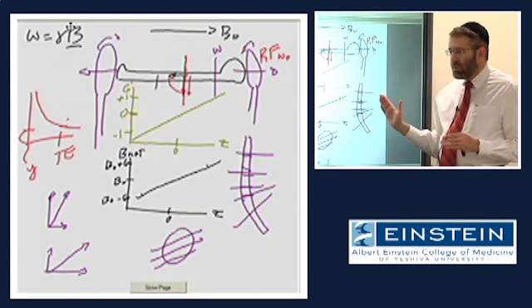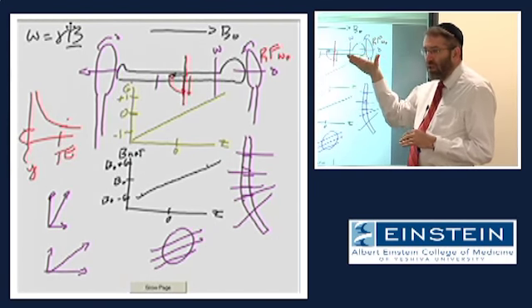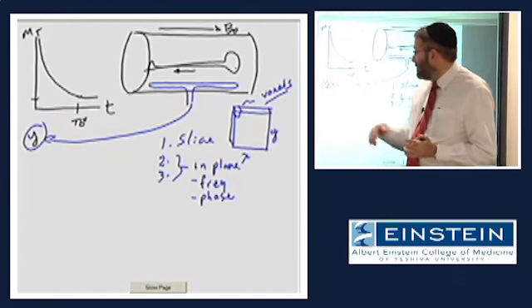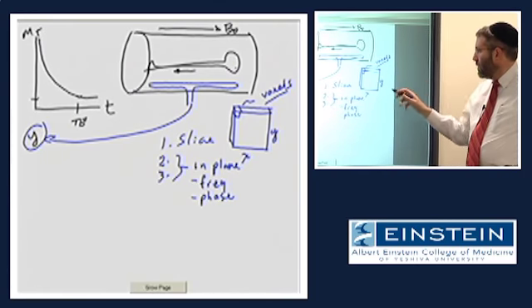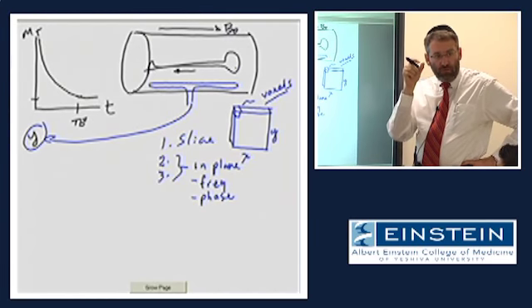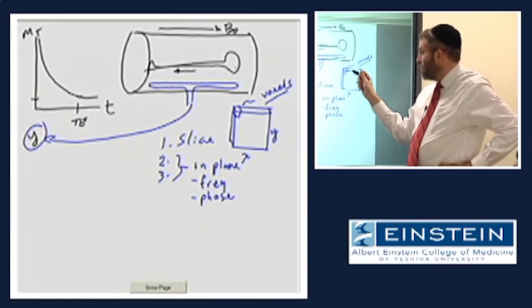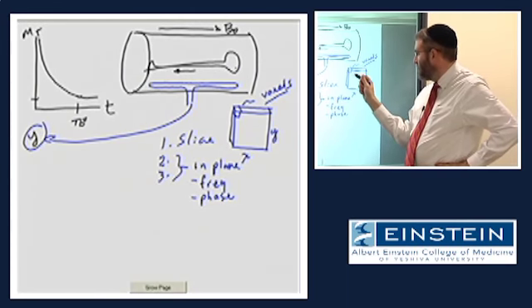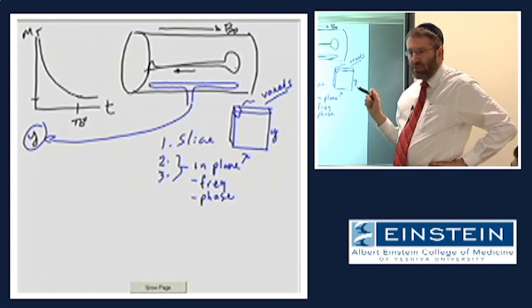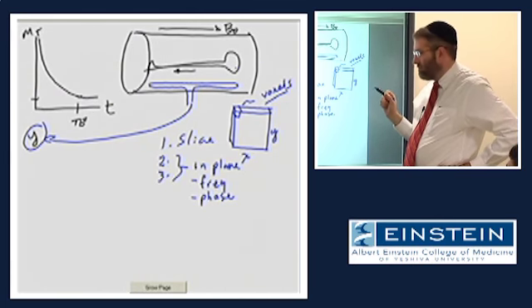So far, we've been able to select a slice, to position that slice, and to orient that slice. If we go back to this diagram, where we talked about the slice being a two-dimensional array of little 3D volumes of tissue, these voxels have 3 dimensions. They have 2 dimensions in the plane of the slice, and they have a 3rd dimension through the thickness of the slice. What is it that determines that slice thickness?